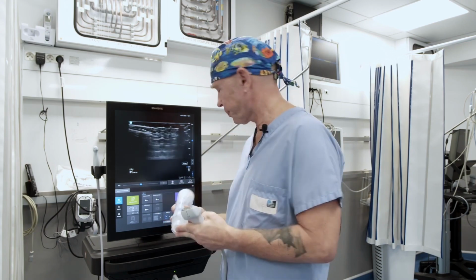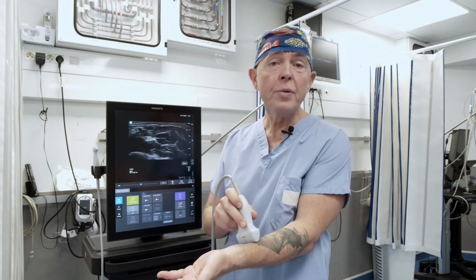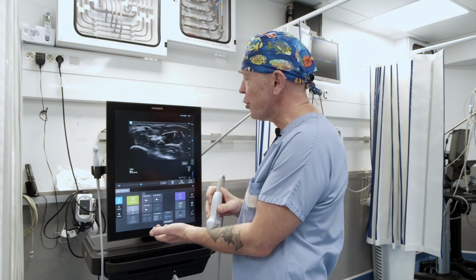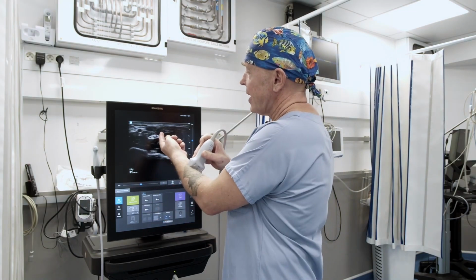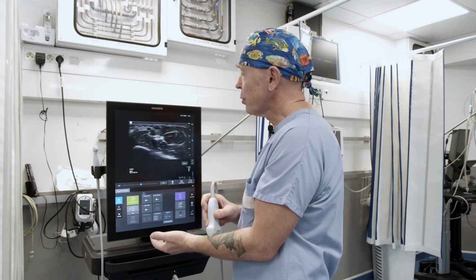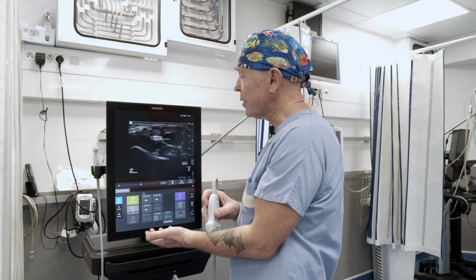Alternatively, you can also practice on a volunteer. You position your ultrasound probe centrally on the forearm and search for an image that corresponds to a nerve. At this point, we observe that directly in the center, there exists a heterogeneous image featuring a delicate white line, somewhat resembling a honeycomb structure. This is indeed the quintessential appearance of a nerve when viewed through ultrasound imaging.